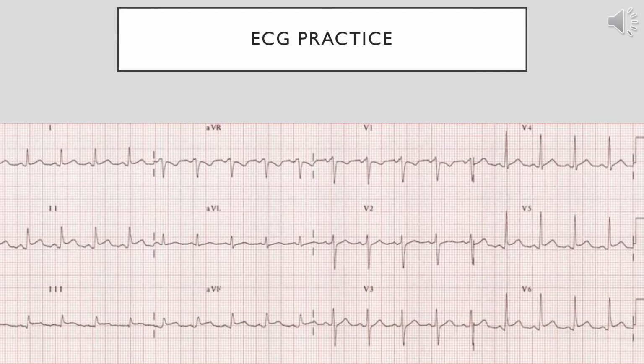Other considerations for this patient: they're in tachycardia. We want to make sure they don't have any type of fluid overload or pericardial effusion or something like that. These are some things that you'd want to think about with ST elevation.